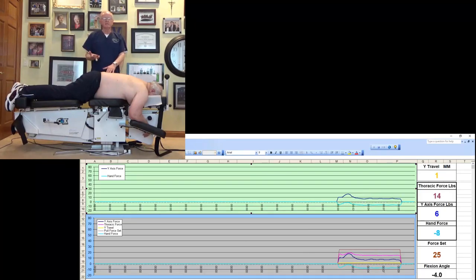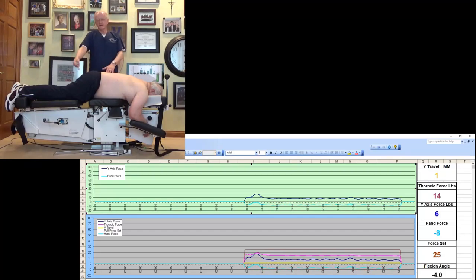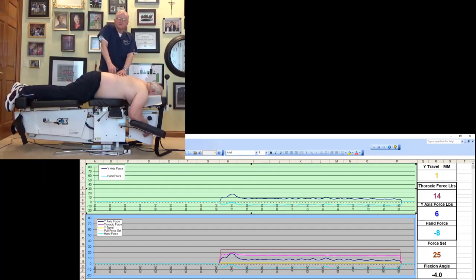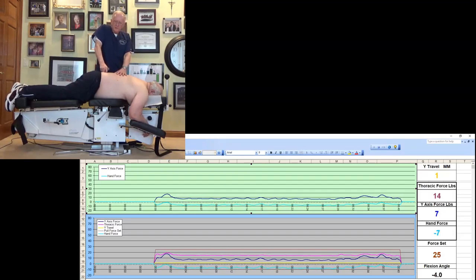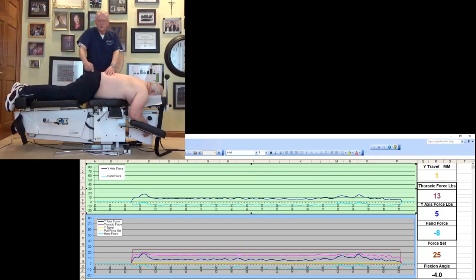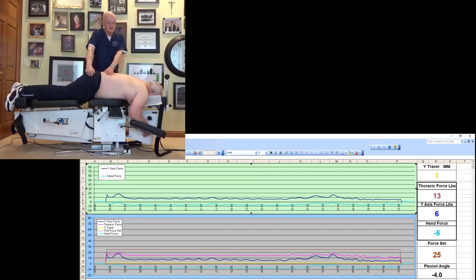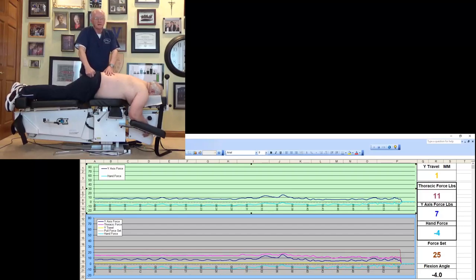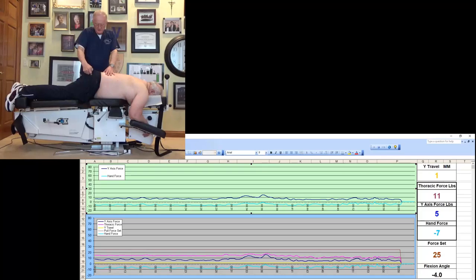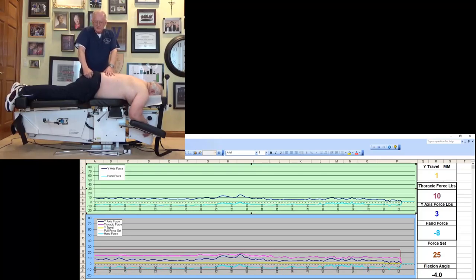So when we treat this condition, we're going to contact L4 because we have degenerative stenosis at the L4-5 level and a large left-sided L5-S1 disc prolapse. We always treat bladder meridians B22 to B35, B49 to B54. So deep multifidus. If you look, these are really deep multifidus, iliocostalis, lumbodorsal fascia. So we just goad these with a fairly firm compression. Prior to distraction, we move to the posterior retro trochanteric fossa. We call this the Going syndrome, right? The gemelli obturator internus complex. The gemelli inferior, gemelli superior, obturator internus, and the large piriformis muscle. Inserting here. So we treat these acupressure points.